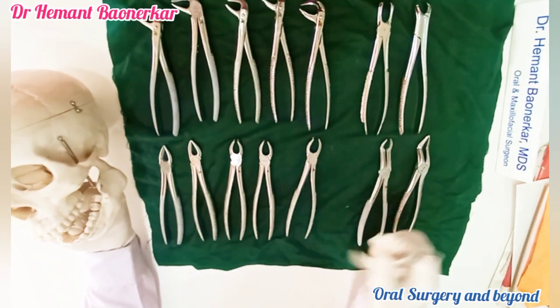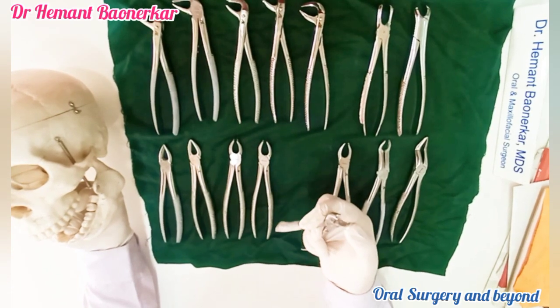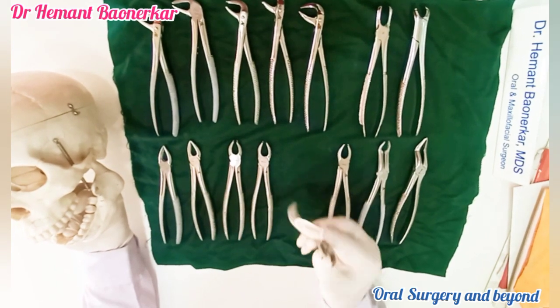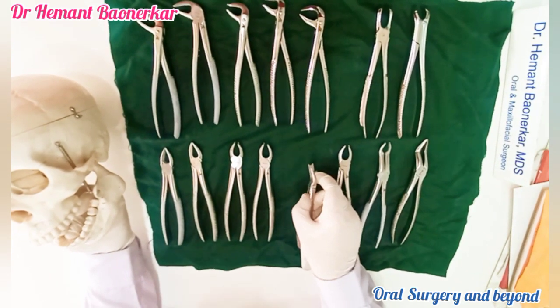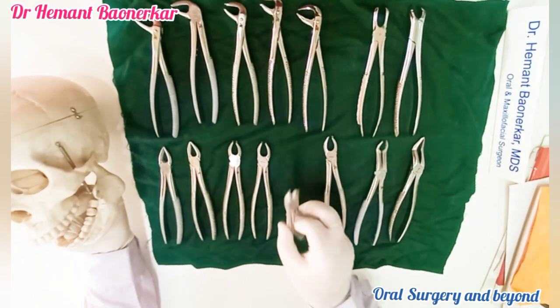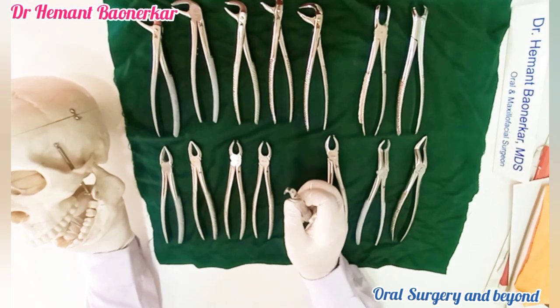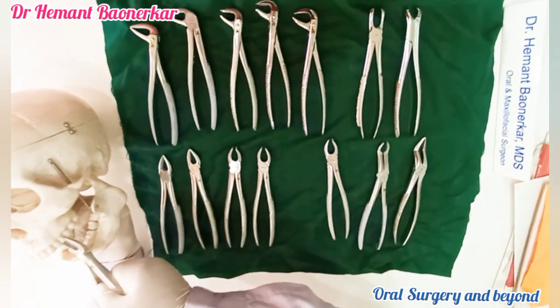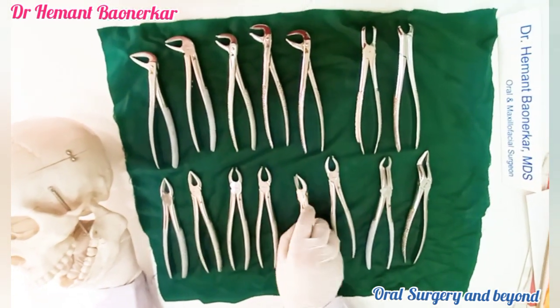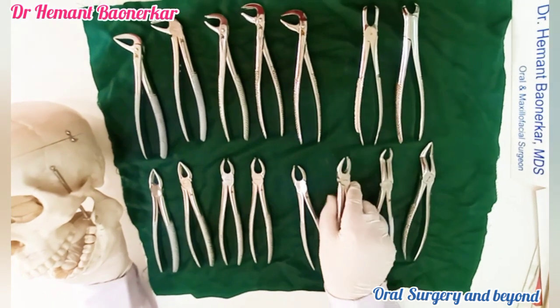These are the two cow horn forceps. Why are they called cow horn? Because one beak is shaped like a cow horn. The palatal engagement beak has a crater-like portion. This is also a paired instrument. This beak always goes to the furcation of the buccal maxillary two roots. This one is for the second quadrant — the cow horn goes to the buccal side. This one is for the first quadrant — cow horn also goes to the buccal side.